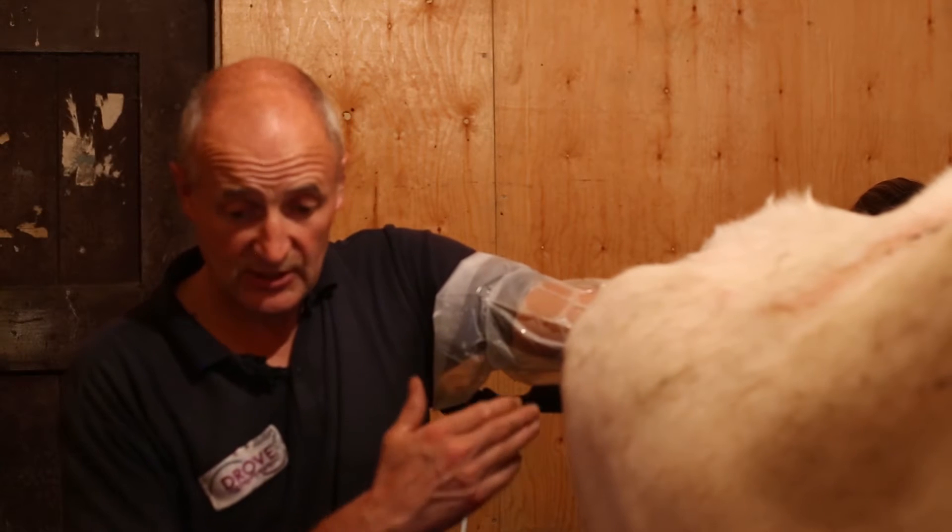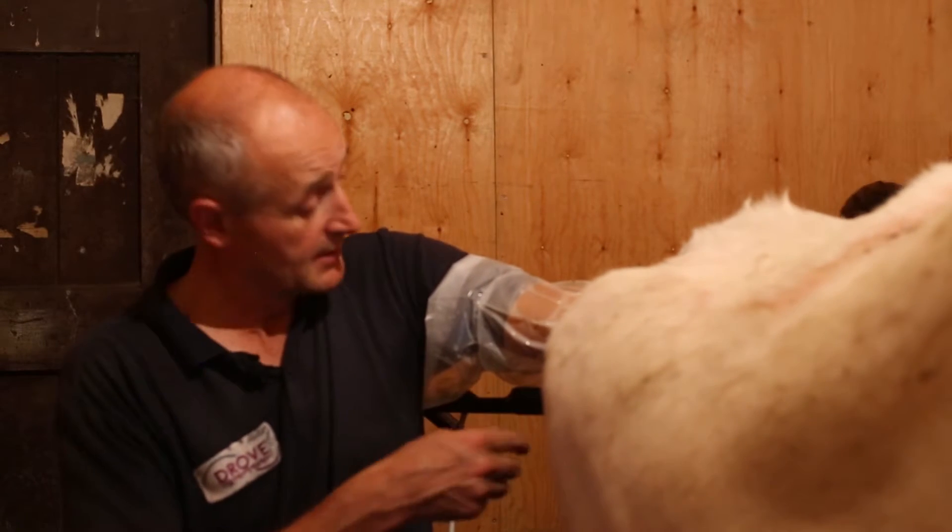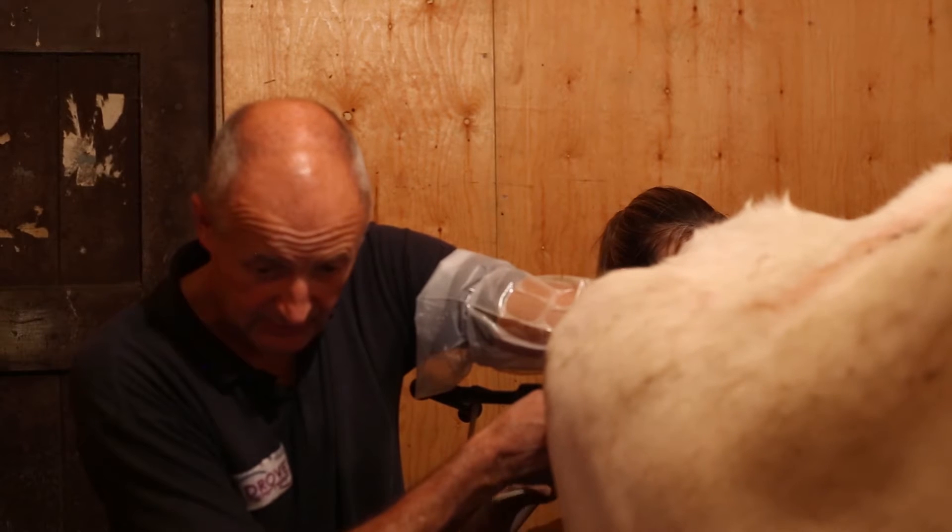In between each session what I'm doing is lining up some nice follicles ready for the next collection session.